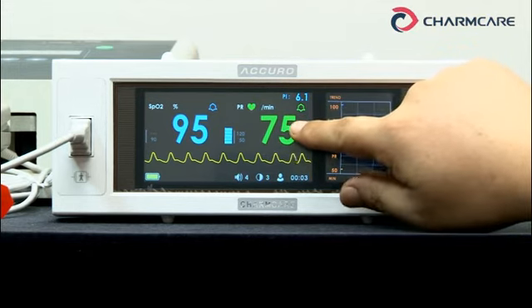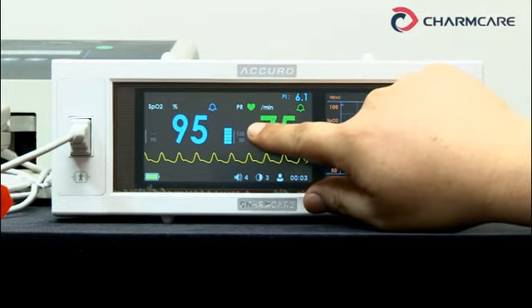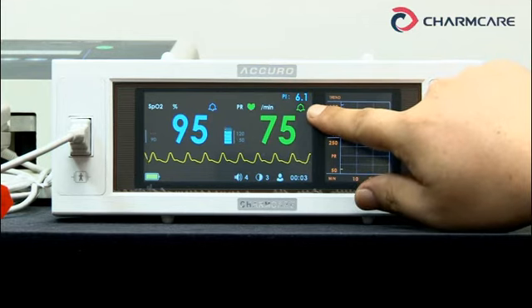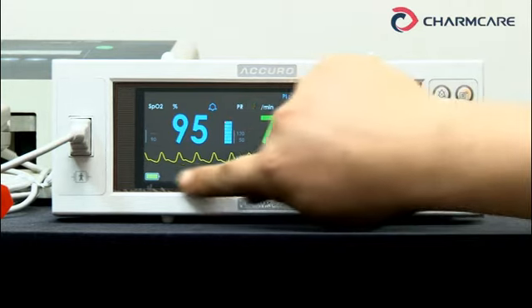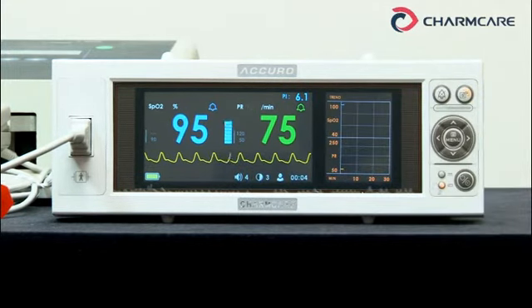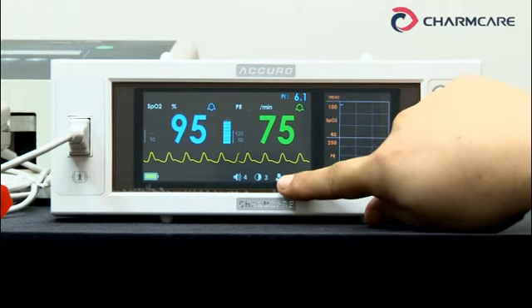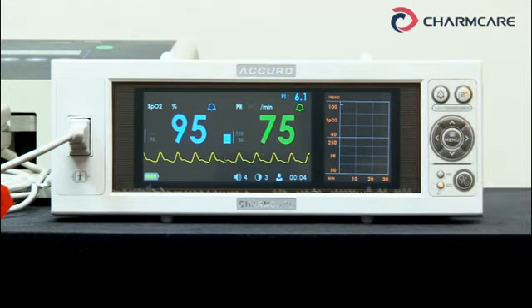This is the pulse rate reading value. This small number is the pulse rate high alarm limit. This small bell is the pulse rate alarm status. This line is the SPO2 waveform. This line shows system status setting data: battery status, printer image if connected — but it's not connected now — pulse sound level, screen brightness, patient type — now it's adult — and current time. This area is for short trend; it shows the previous 13 minutes of SPO2 and pulse rate data.